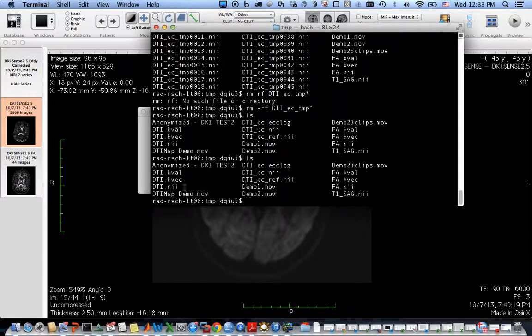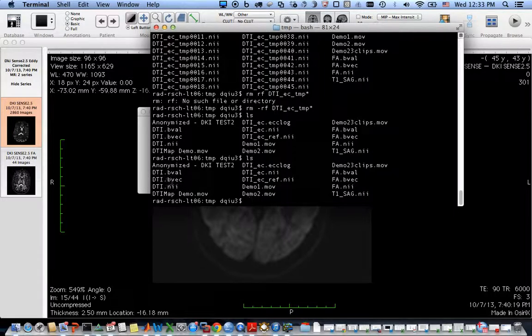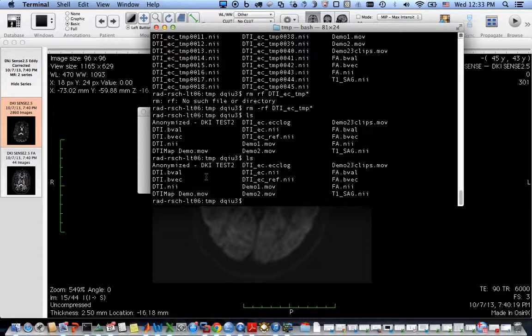If the plugin detects that the dataset looks like a DTI dataset, it will generate these two files: DTI.bVec, DTI.bVal. These are the B values and gradient encoding directions.